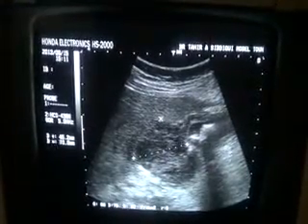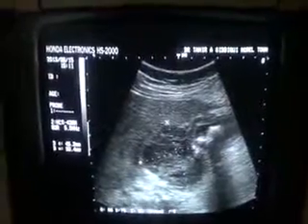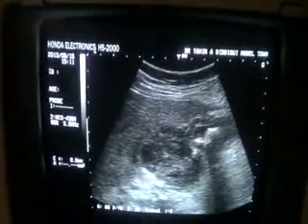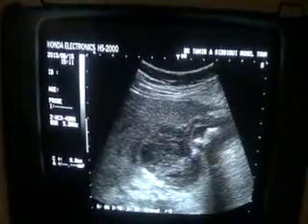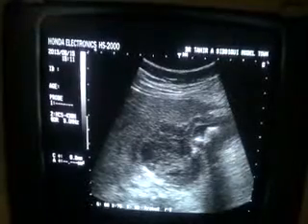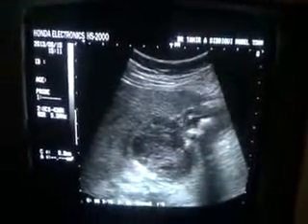seen, measuring approximately 5 by 4.5 centimeters, and not only this, in this collection you can see there are different strength internal echoes, and there is heterogeneity of this fluid collection, and you can see the posterior wall acoustic enhancement from this collection, suggesting that this is an abscess formation post acute cholecystitis.